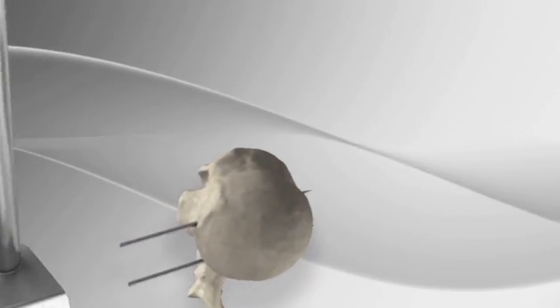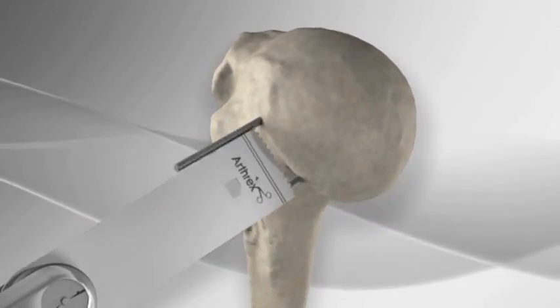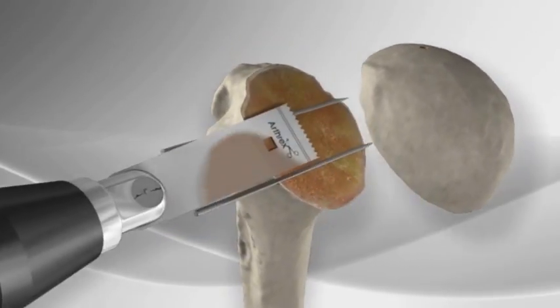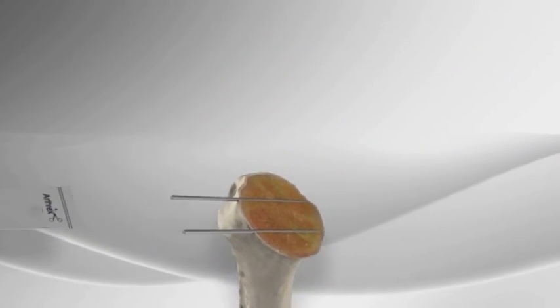The guide is removed and a bone saw is used to cut the humeral head using the pins as a reference. The top portion of the humeral head is removed along with the pins.